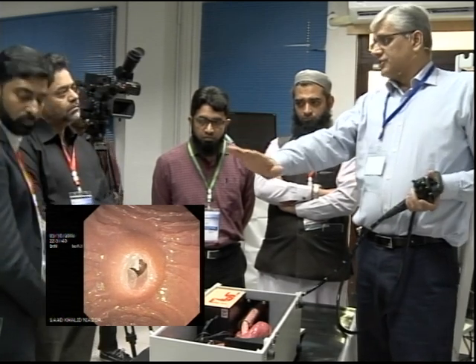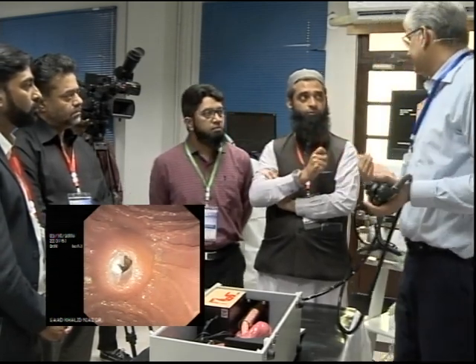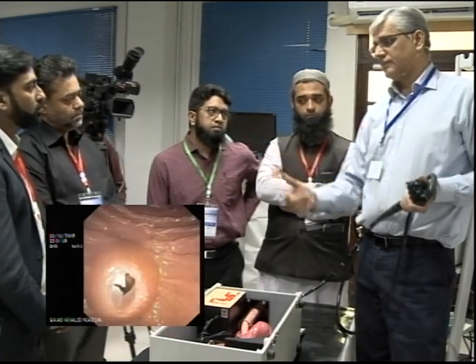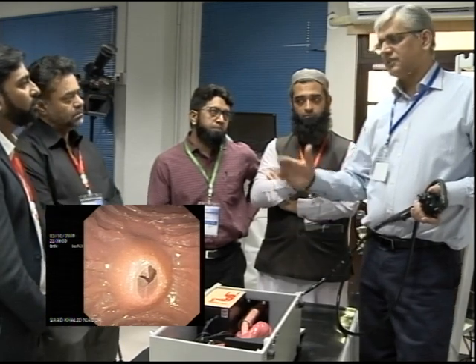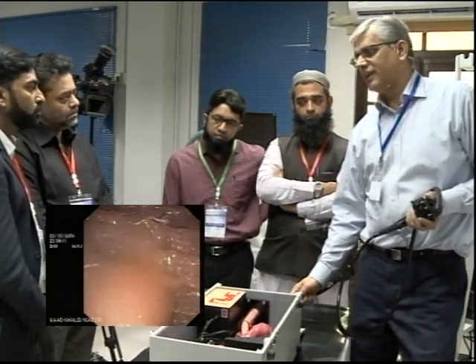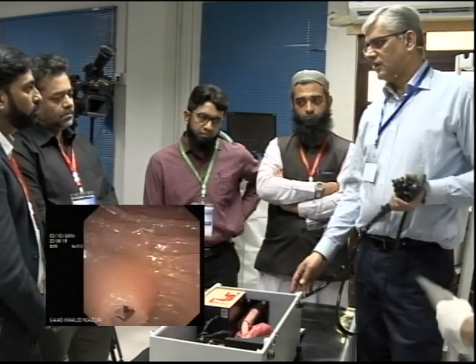Once you've got your position, what do you do? What are the options we have of bringing the ampulla close to us? Big wheel down. Big wheel down, it comes close to us. Good. That takes it away. Both are important. Suction to minimize, but suction doesn't help you that much. Pulling of the scope. So shorten the scope, it might not work here, but even here you can see just pulling back. So that's two. What else?